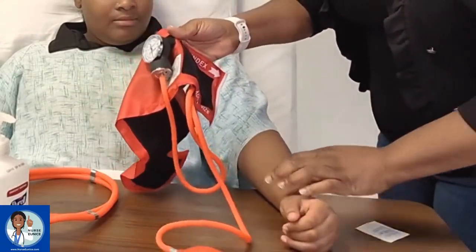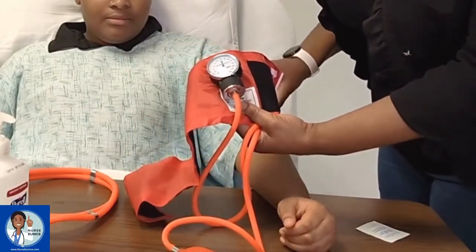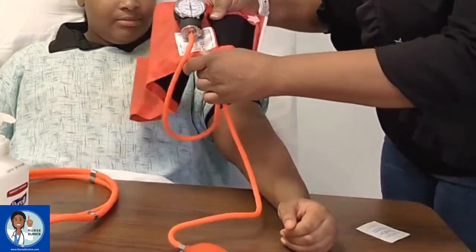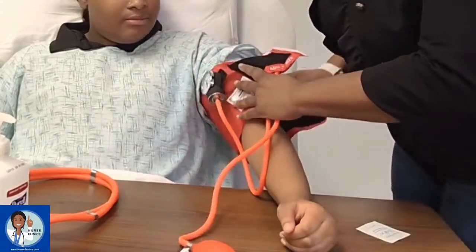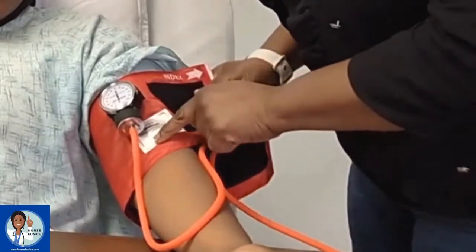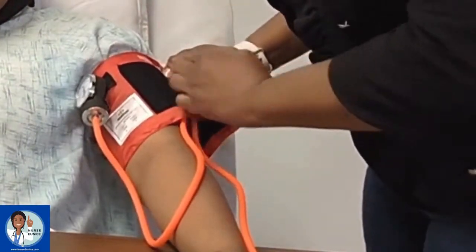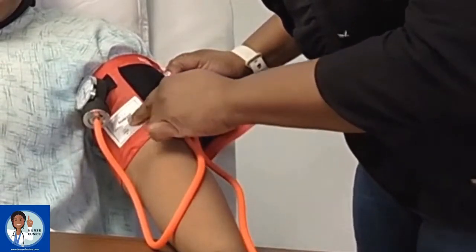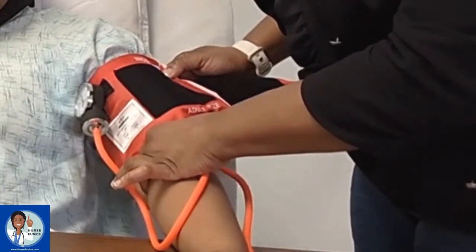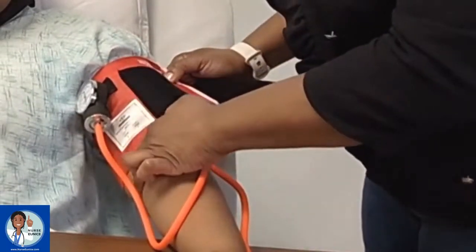Prior to placing the cuff, we have Anija's arm on a flat surface. She's sitting upright with her arm at the level of the heart. We're going to bring the sleeve up. When applying your cuff, it has artery indicators — arrows on the actual cuff. With the palm up, the arrow points to the brachial artery on the inner aspect of the left arm. That's also the location where you'd be putting your stethoscope. Knowing the position of your brachial artery is important.